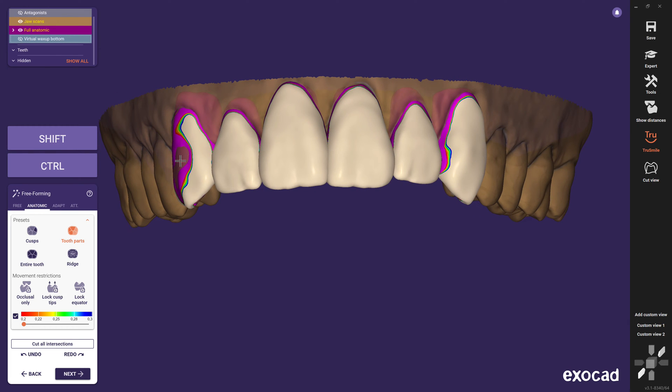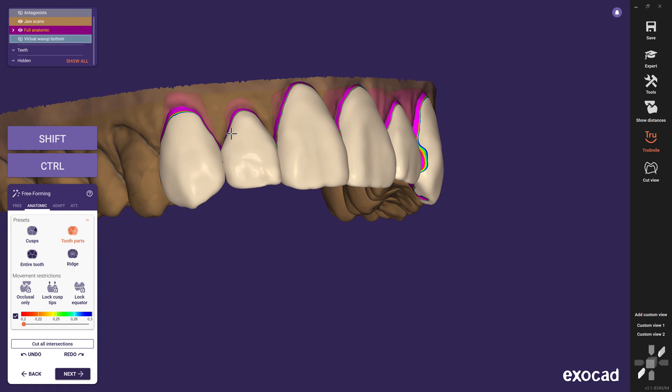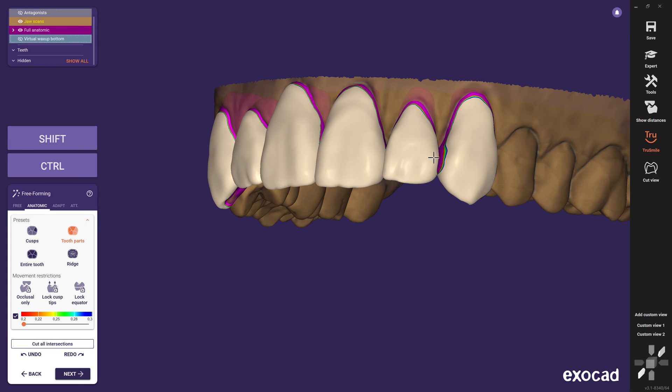Keep in mind that we have no layer of minimum thickness like a crown or bridge. Therefore, we can create a hole inside the structure if there is no material at all. If you design a virtual wax-up or mockup model, this visualization is not that essential. For a clip-on, on the other hand, this is a great advantage.